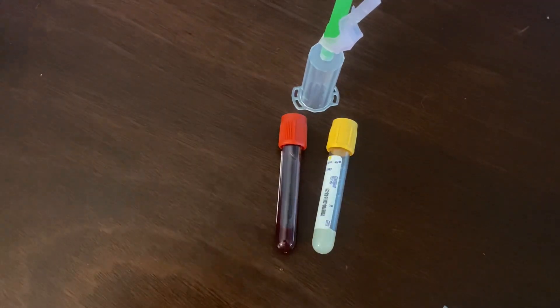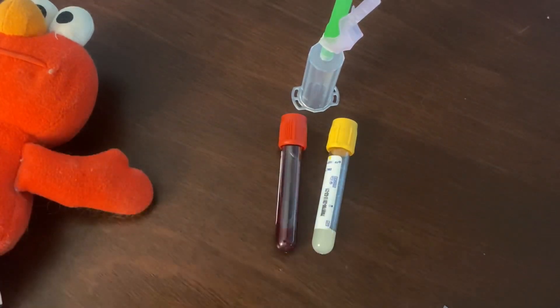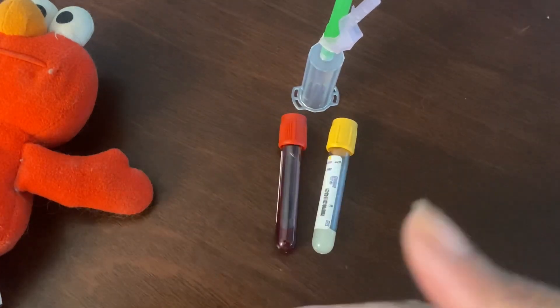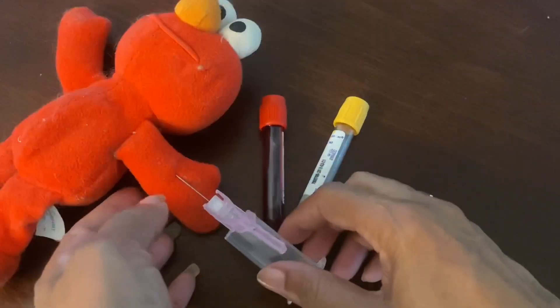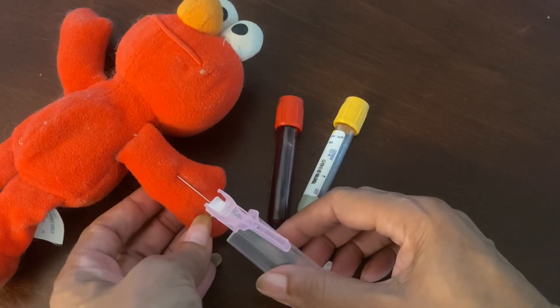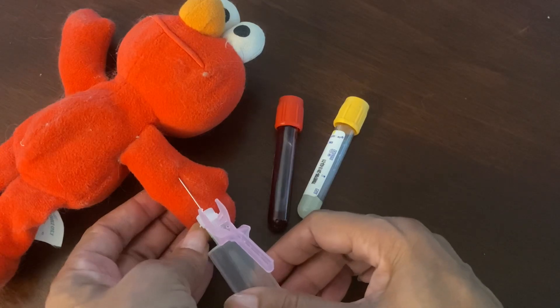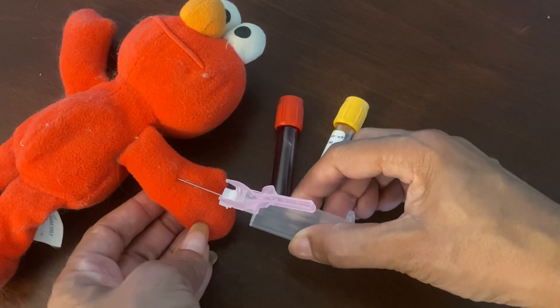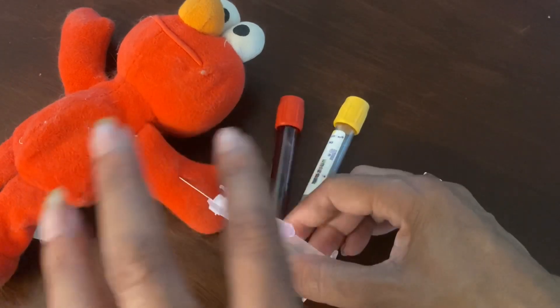We are going to use Elmo again today, his poor little arm here, because what we're talking about — we have discussed the last few days how to redirect. We've talked about blood flow, what to do, those three moves as far as if you're in and you're not getting anything. We've talked about if you're in a vein, how to pull back and that gradual, gentle movement to the right. And of course come back — nothing over there. And then this is how you make those gentle moves, back to the left. That's a quick redirect.